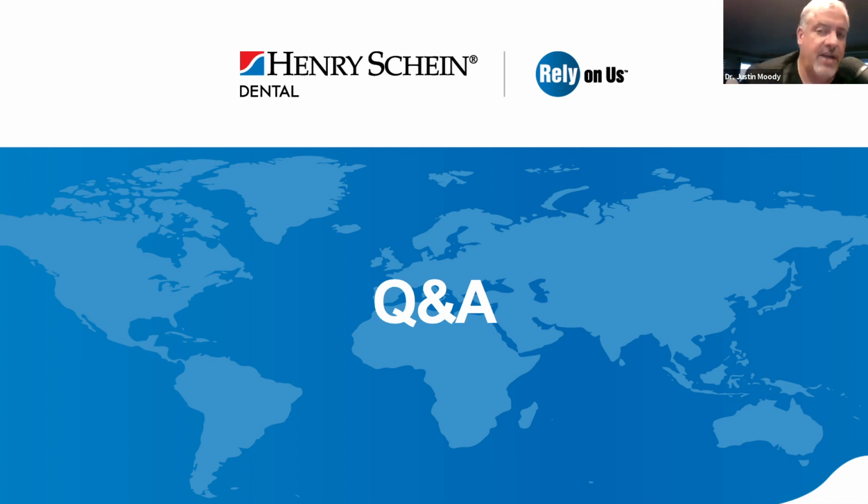So what I know about the Acteon software is it comes with the machine. If you want to buy it separately, you can get it. And then there is no fee. So you can make as many guides as you want from that software.